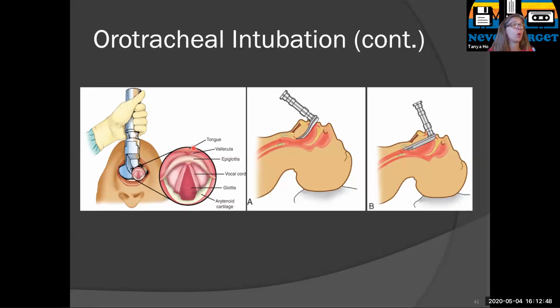Anyway, this is what you want to see here. And this is just a picture of how the two different blades sit in the patient, and different ways of being able to visualize. Okay, so you just go ahead and develop. I don't know of any data that supports one is better than the other. It seems to be just all by preference. And so you'll just figure out which one you like better and use that.